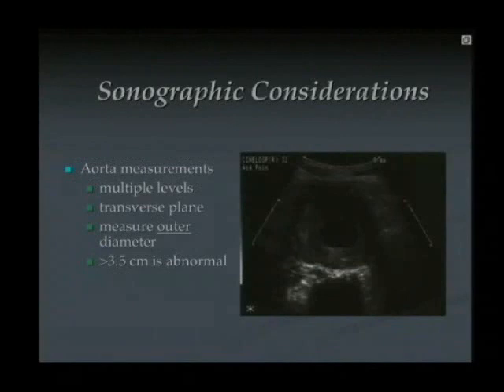with abdominal pain, flank pain, back pain. There are lots of cases of rupture at 3 centimeters, 3.5 centimeters. So if you're in this gray zone area, just call someone else. Let them make a judgment whether it was really musculoskeletal pain, not that small aneurysm that you found.